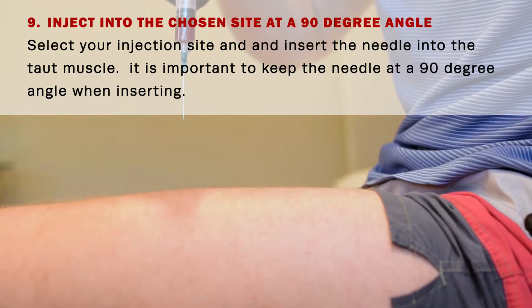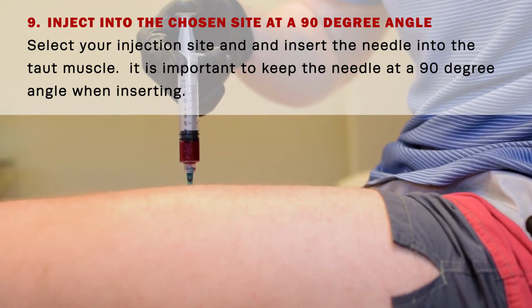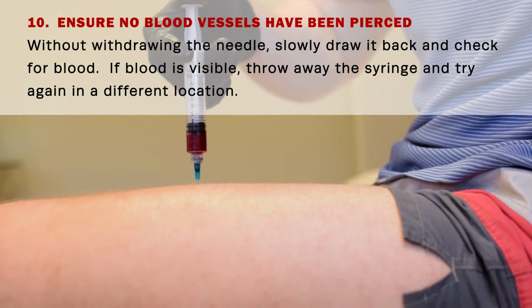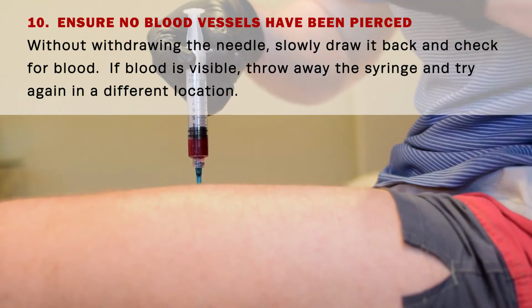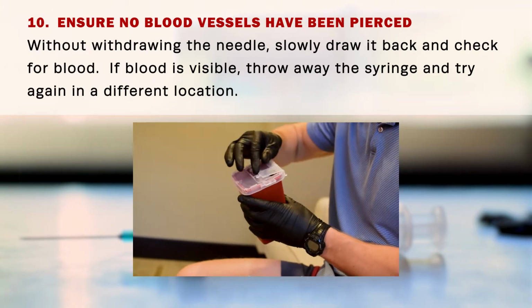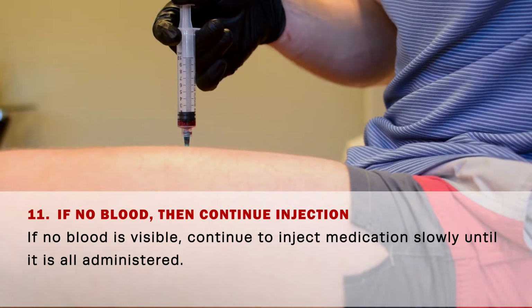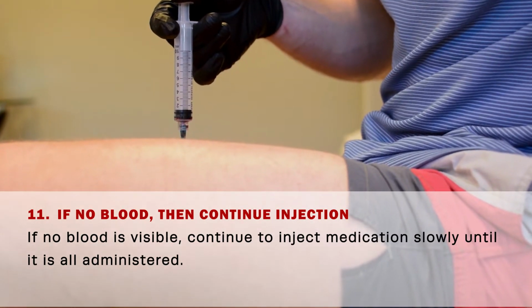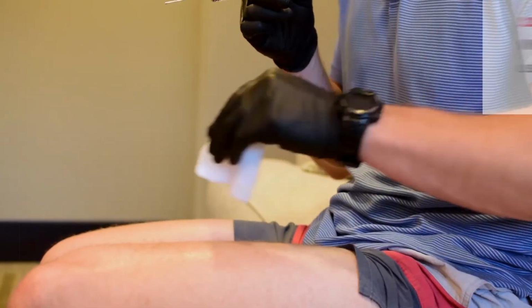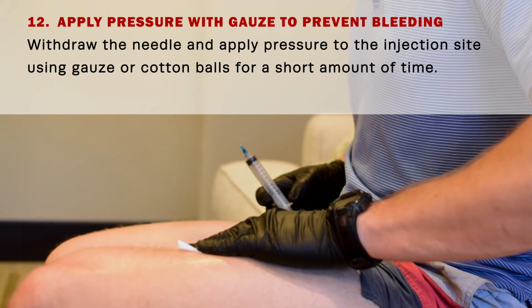Choose your injection site and insert the needle at a 90-degree angle. Without withdrawing the needle, slowly and slightly draw it back to ensure you haven't pierced the blood vessel. If blood is visible, discard the needle and begin again in a new location with a fresh needle. If no blood is visible, continue to inject the medication slowly until it's all administered. Apply pressure to the injection site for a short period of time with gauze.